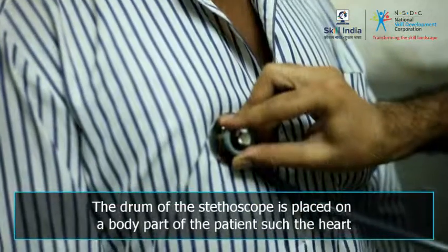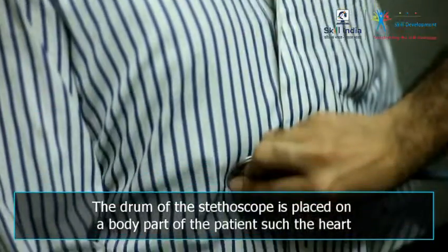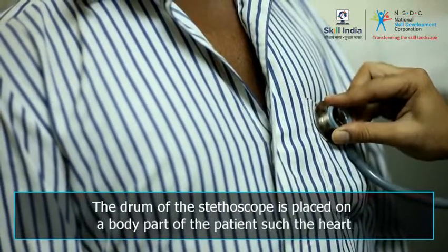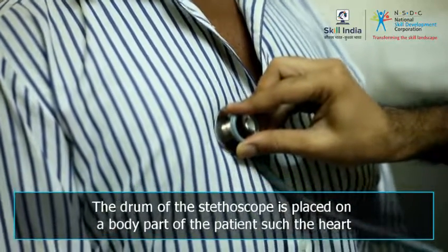The drum of the stethoscope is placed on a body part of the patient, such as the heart or the lung. The stethoscope has two ear pieces that are placed by the doctor in their ears to listen to the sounds.